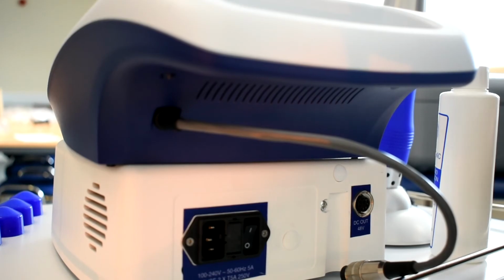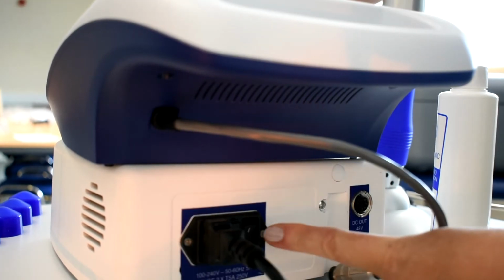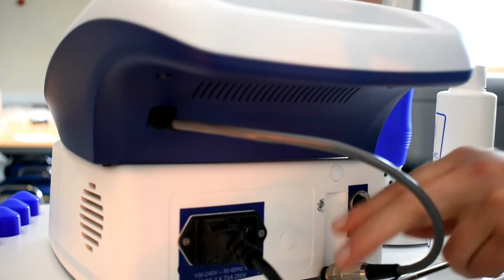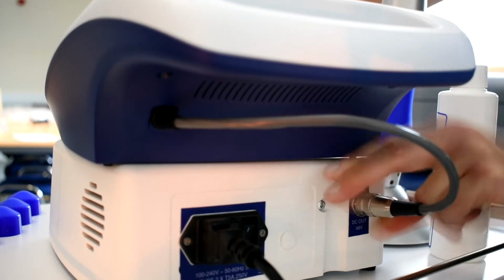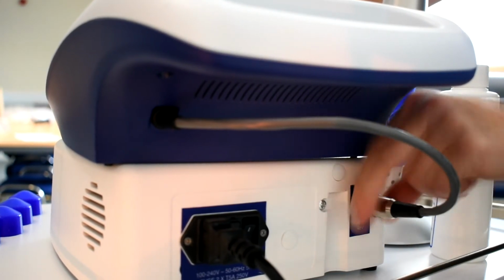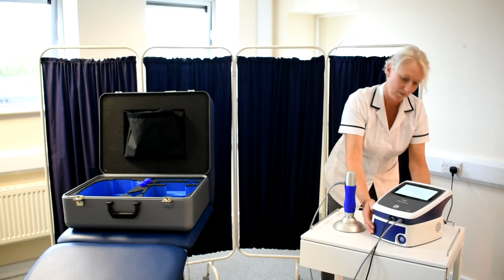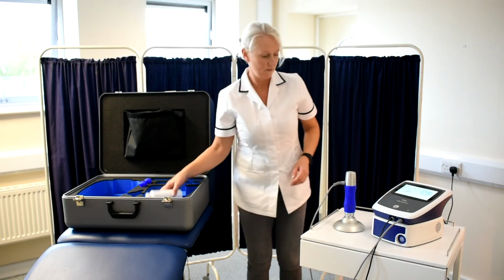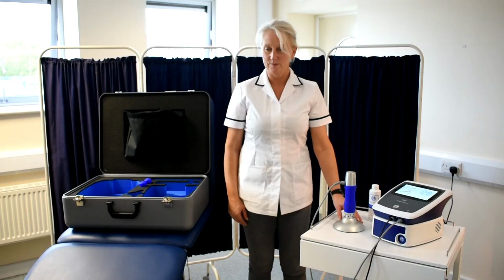When you are ready, plug in the mains cable to the power supply, making sure that the main switch on the unit is in the off position, and connect the power supply to the shockwave unit. When everything is connected, switch on the main switch and on-off switch, and the splash screen will appear. Then you're all ready to start treatments.